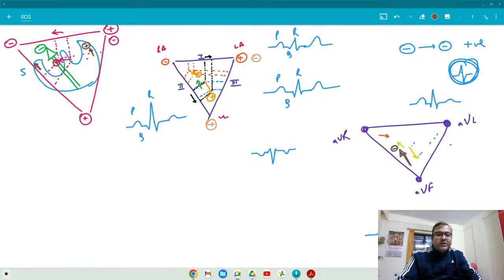Acha, now tell me one more thing. We have got two situations. We have discussed lead 1, 2, 3, and we have also discussed another thing, that is lead AVR, AVF, and AVL. Do you know that there is something called a unipolar lead and something called a bipolar lead? So, what do you think? Both are unipolar leads, or something is unipolar and something is bipolar, or something like that?